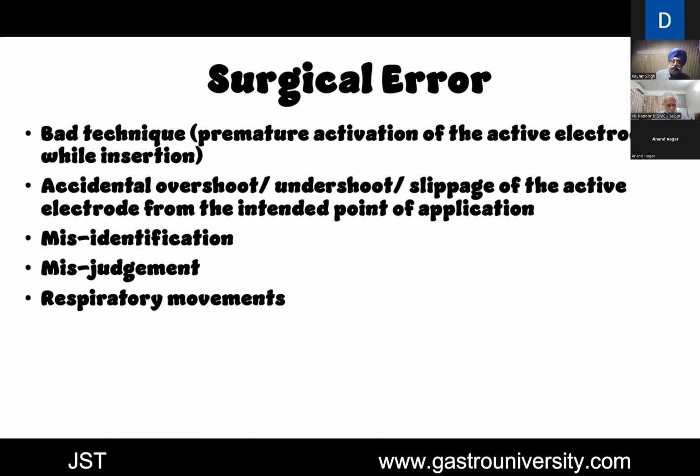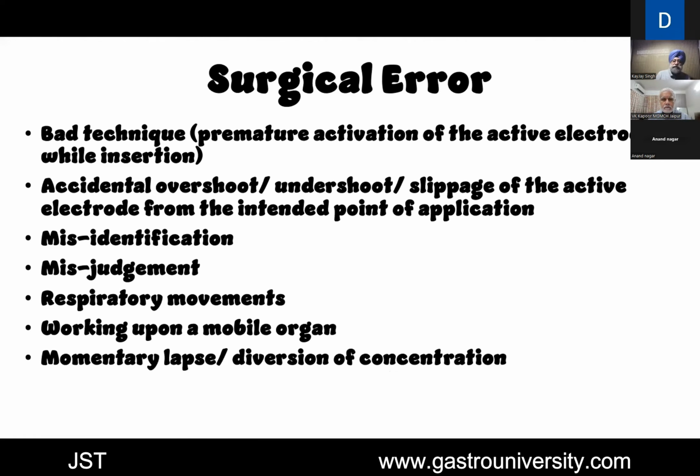If we are doing cautery, we can request the anesthetist to give a pause of apnea, and that can help us in not applying it to a wrong place. Working upon a mobile organ like an ovarian cyst, and obviously in tense distended gallbladders also, this may be relevant. When the organ slips and keeps moving, at a particular point of application of energy it might slip. Momentary lapse or diversion of concentration of the surgeon is very important.